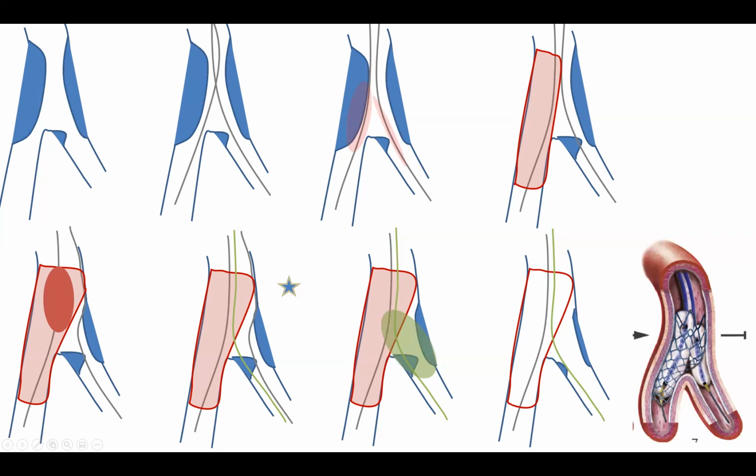Okay, so you do that kissing balloon. I do my kissing balloon by up to 12 atmospheres, 10 to 12 atmospheres. Not higher than that, but up to 12 atmospheres has been used in studies.